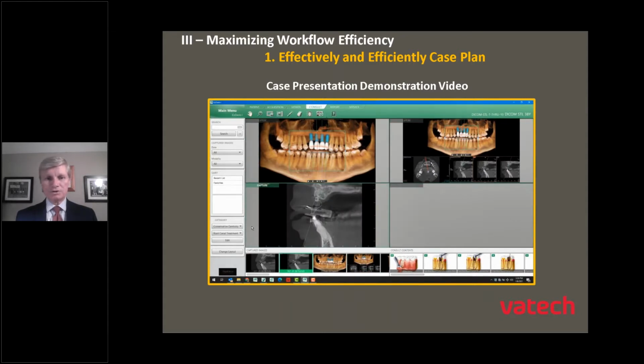And then lastly, what I'm going to do in that 4th window, I hit a drop-down list along the left-hand side in case you didn't notice that. And there are multiple categories. I think there's like 9 categories and 1 custom category at the very bottom. And what I'm going to do is choose the category for implants. So we'll go ahead and play here again. I click on the implant category.